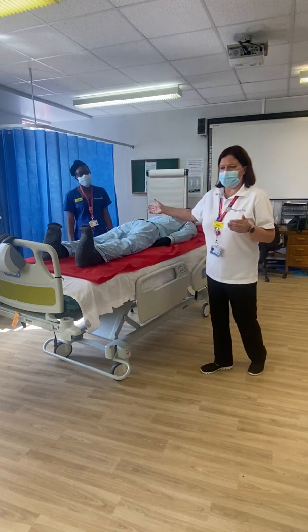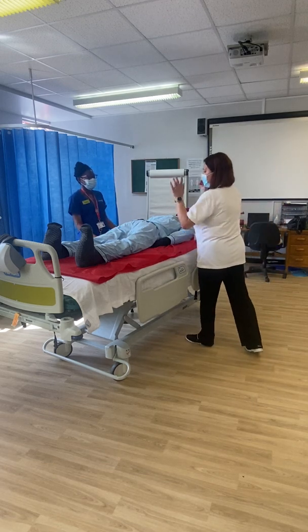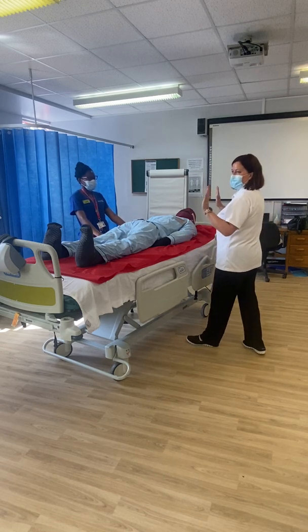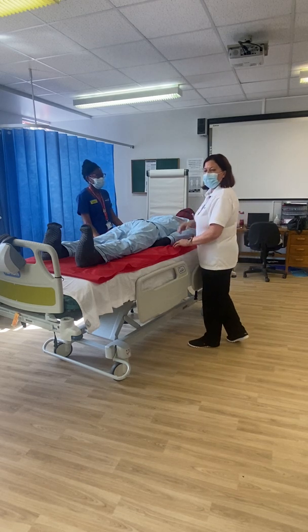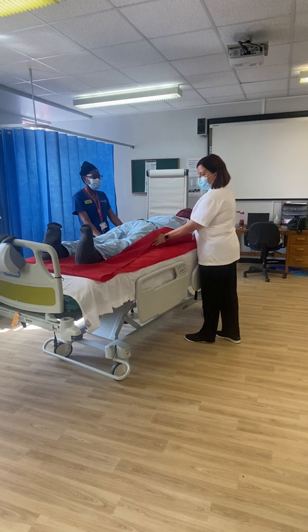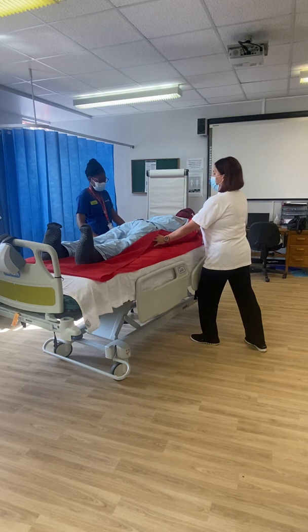If we wanted to go across the bed, this time we adjust our step into a step stance. And if we were going towards Priscilla, Priscilla would take hold of the sheet at hip and shoulder again. And what she does is that she weight transfers backwards and acts as a brake to stop the patient going too far across the bed. I'm responsible for the power of this manoeuvre because I'm going to be pushing, which is much more effective than pulling. So I'm going to lift the top sheet and put my hand flat on the hip and flat on the shoulder. And then on the commands ready, steady, slide, we're going to effect the manoeuvre.